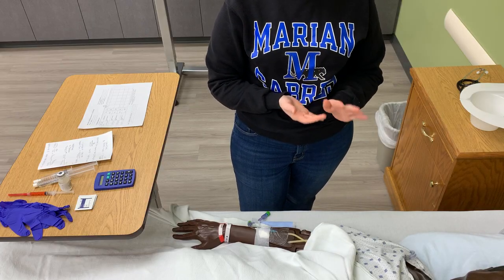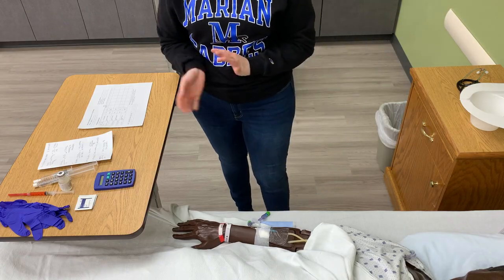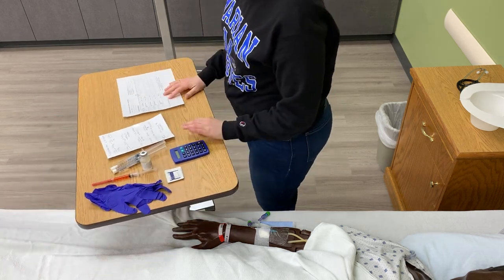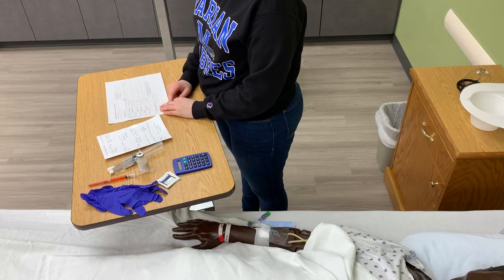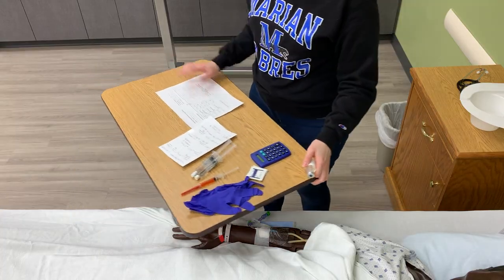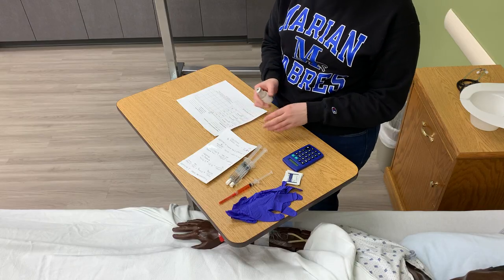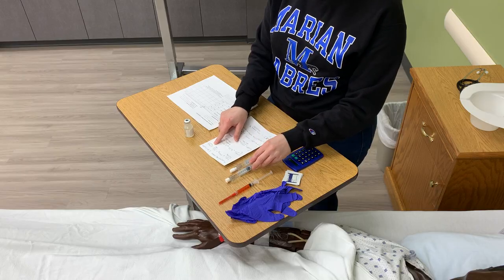And Casey says no. So we are going to do our MAR check and check our equipment, and then we'll do our assessments and then get started with the medication administration. So today we have Casey Banks, 10/2/1965, allergy to aspirin. We have an order for furosemide, and I have furosemide IV. This is for IV use, dose of 20 milligrams. This was 40 milligrams per 5 mLs. And based on our calculations, that gives us 2.5 mLs that we drew up.